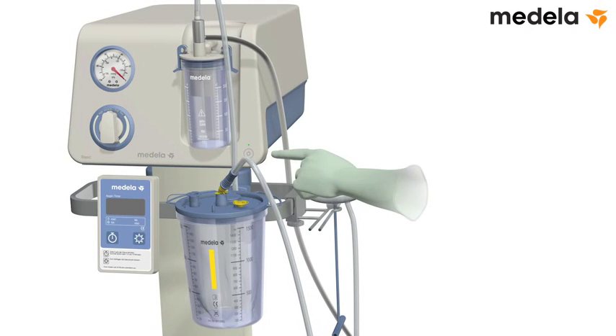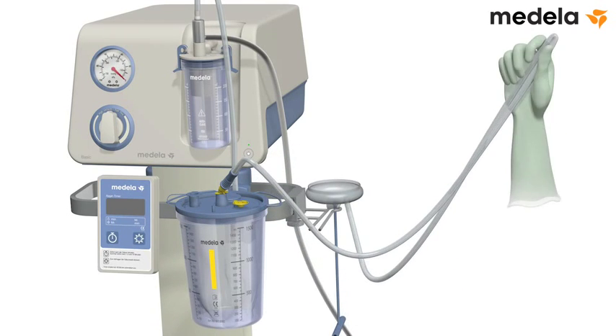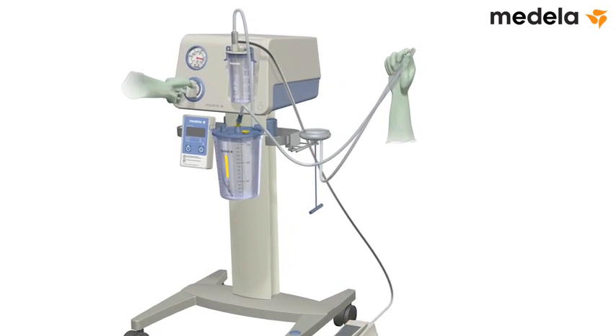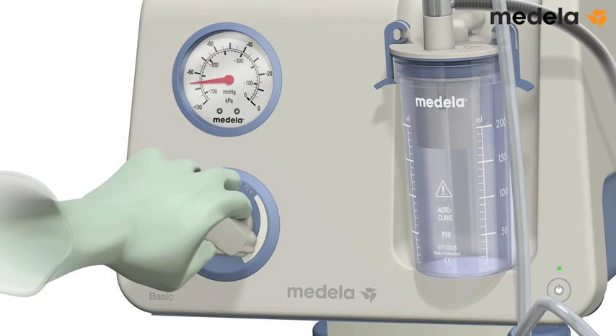To test the vacuum, turn on the pump and clamp the sterile tubing with your thumb and forefinger. Fully depress the foot-controlled vacuum regulator — press forward and down using the ball of your foot. Set the pump to the required maximum vacuum.